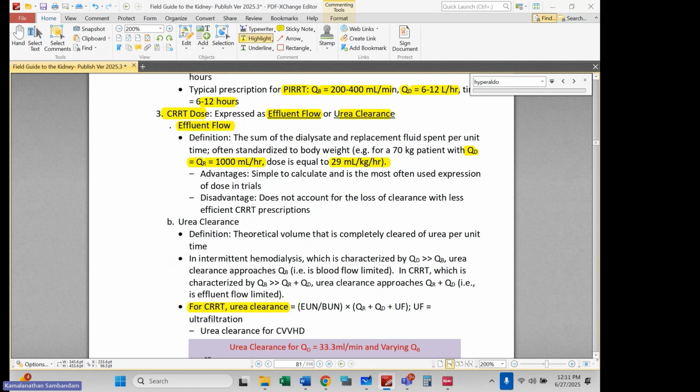because there is no clear threshold or benefit of prescribing 20 mL per kilogram per hour or 25 or 30. I don't go through the trouble of doing that extra math and then transmitting that information to other people I work with. I don't say, okay, let's increase the flow rate by 500 cc's per hour.